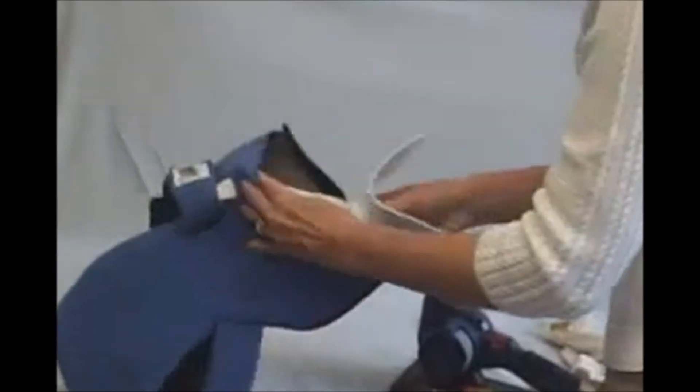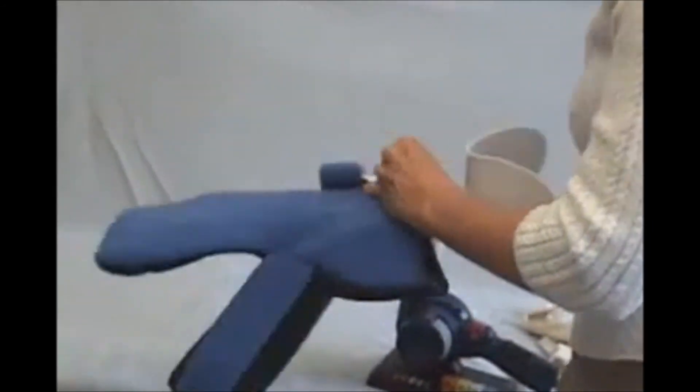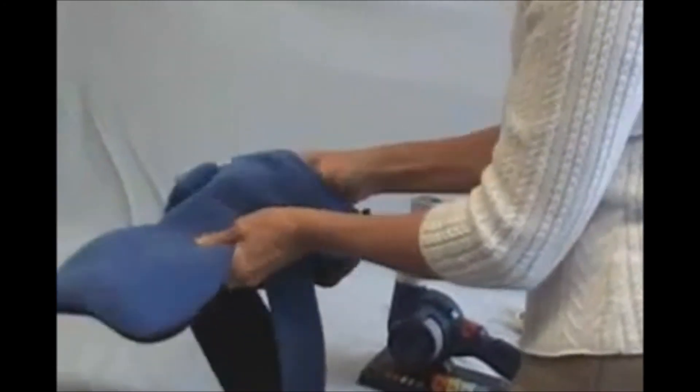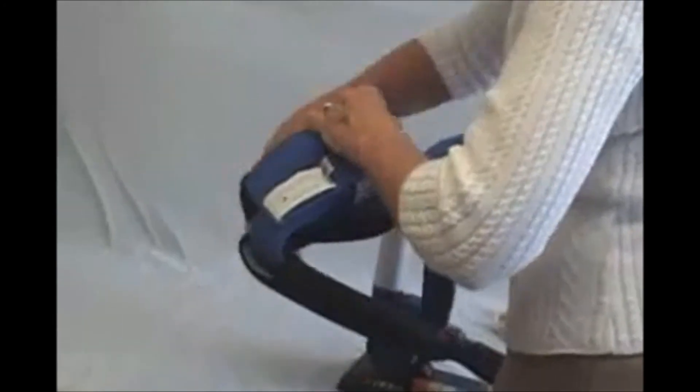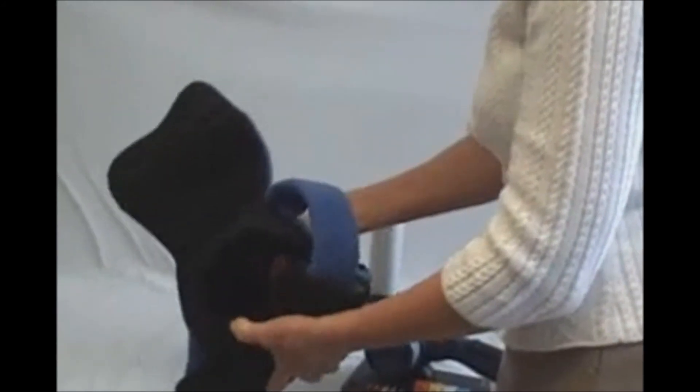I'm going to reinsert it with the curved side toward the patient. The black material is toward the patient. Insert it all the way in. The blue material covers the outside, the black just velcros over, and you're ready to refit your patient.